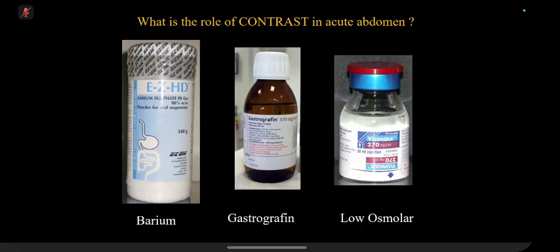So remember these concepts: barium is the best contrast in the GIT in the normal scenario because it gives you very good contrast. If you want to evaluate the esophagus, the stomach, or the large or small intestine, it is the best. Having said that, there are scenarios where you don't want to use it, particularly when you are worried about contrast going outside the abdominal cavity, perforation.